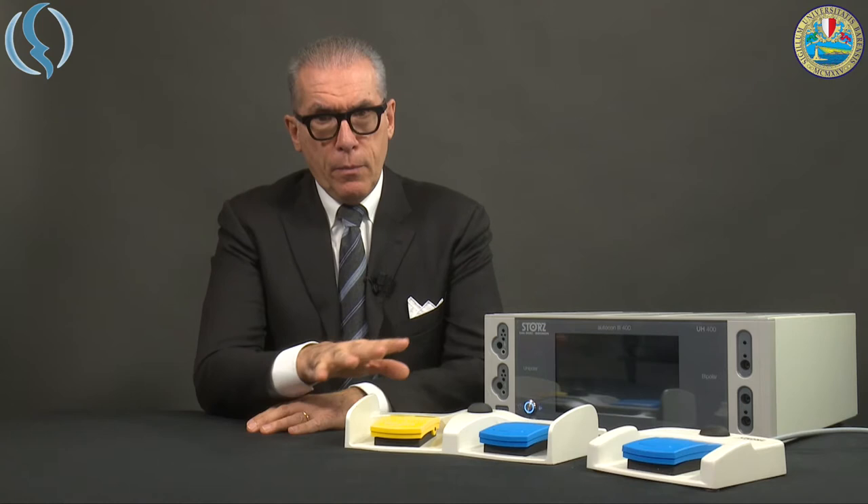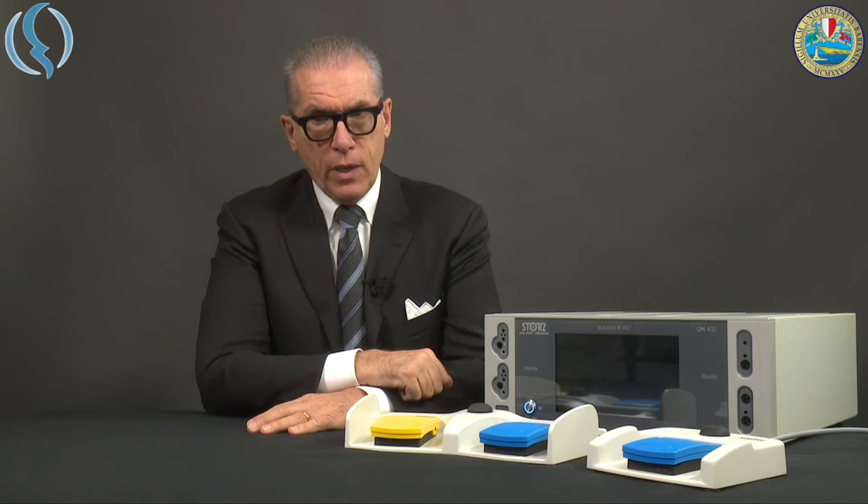You see here the machine together with the two different sets of pedals. The classic one with cut and coagulation — cut is yellow, internationally yellow and blue for coagulation. The single one can be used only for coagulation. These two pedals can be connected simultaneously on the rear part of the machine, as I will show you later.